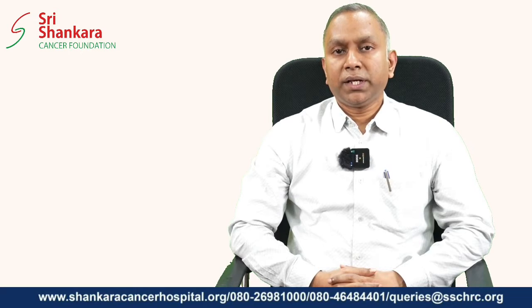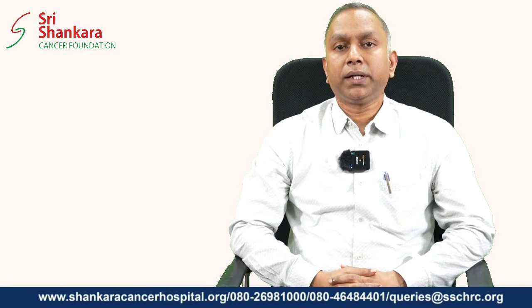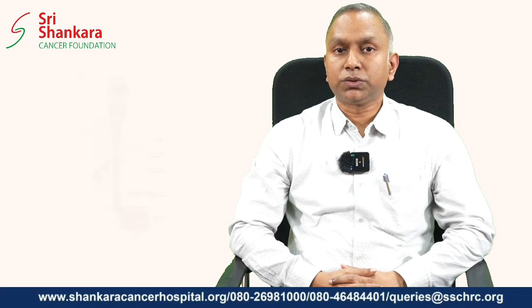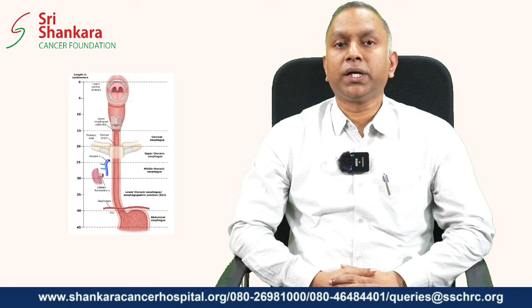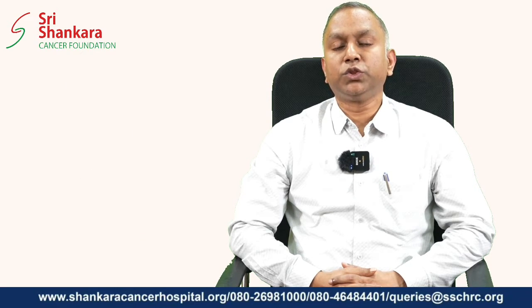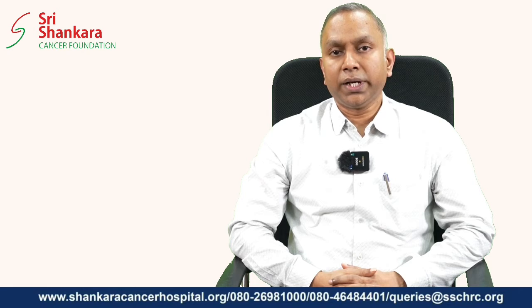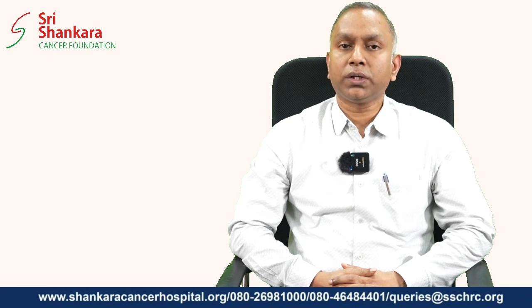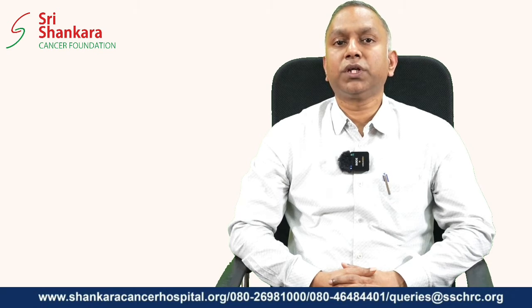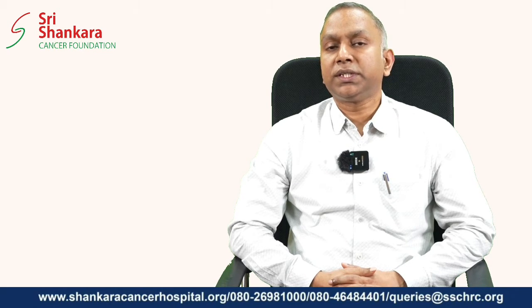The other common area where brachytherapy can be done is, again, interstitial brachytherapy. That can be done for carcinoma of the tongue. Generally, the tongue is an organ located in the head and neck region. Once the surgery has been done, in the adjuvant setting, in addition to external radiation, or brachytherapy alone, interstitial brachytherapy alone can be done for the tumor bed. So the process is the same.